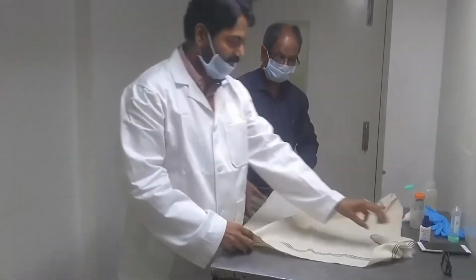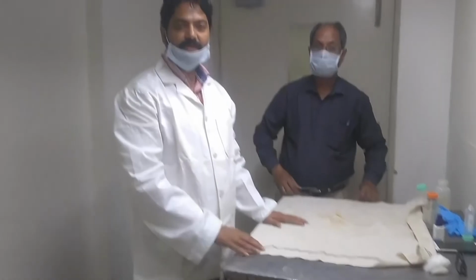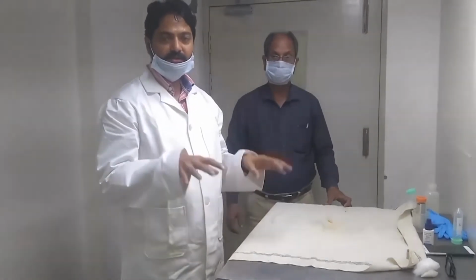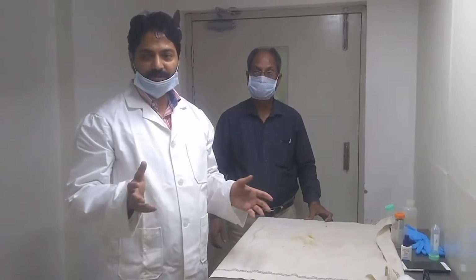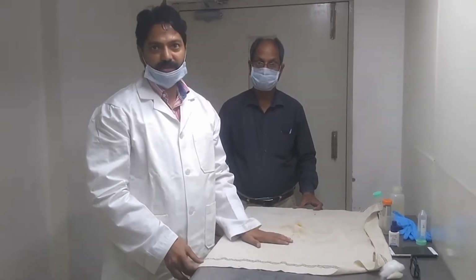To restrain the animal, we use a towel or this kind of cloth. The advantage of having this cloth to restrain is that the animal has its claws outside of the cloth, and then it cannot move. So we have to restrict the movement. Pain is similar in the restrainer and on this cloth.